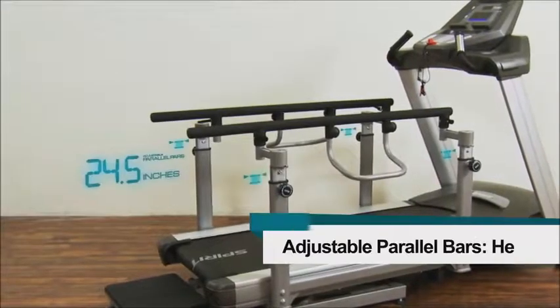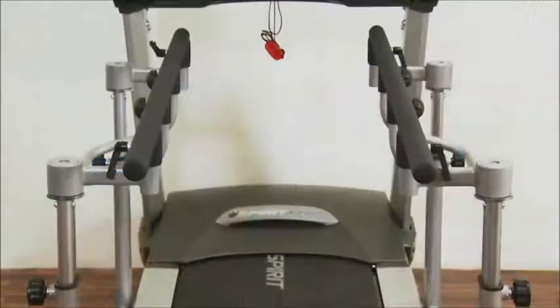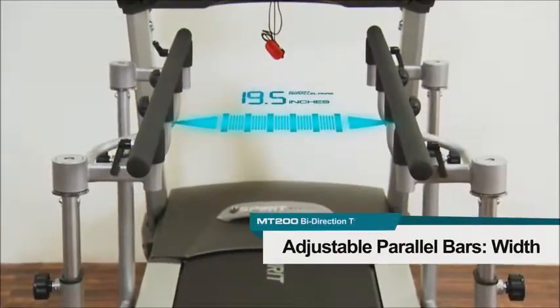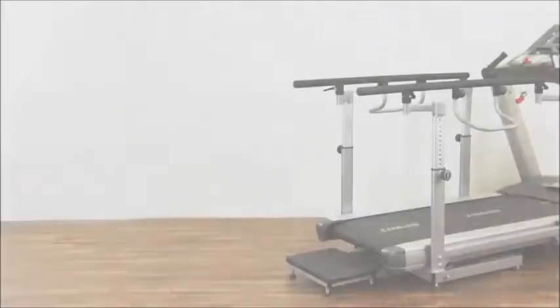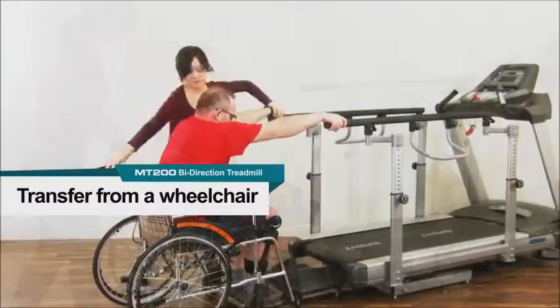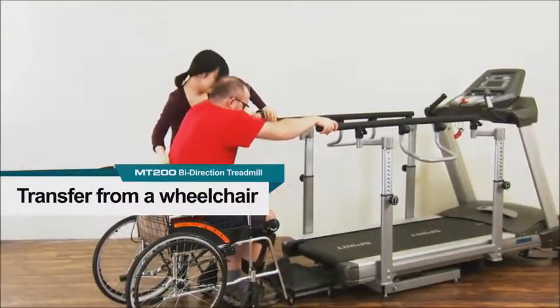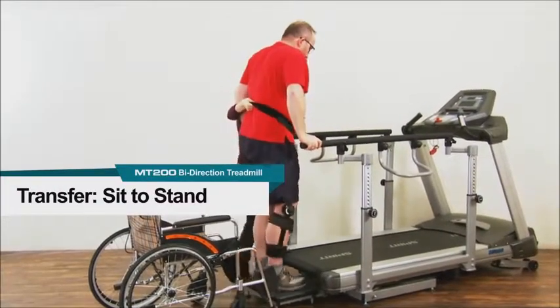The adjustable full-length handrails accommodate a wide variety of populations. The handrails adjust in height from 24.5 to 34.5 inches and in width from 19.5 to 31 inches. The parallel bars can be used for sit-to-stand assistance as well as during a get-up-and-go action.